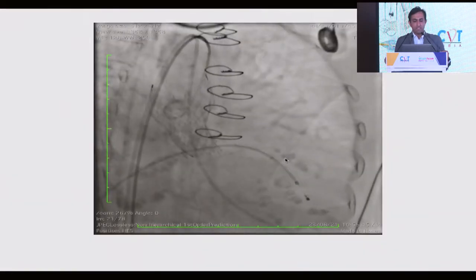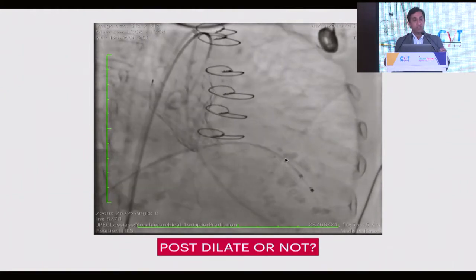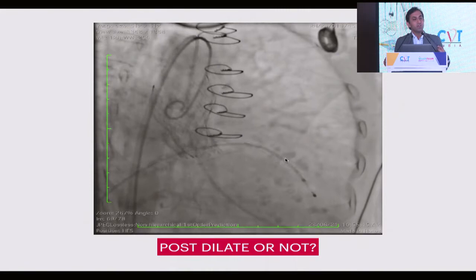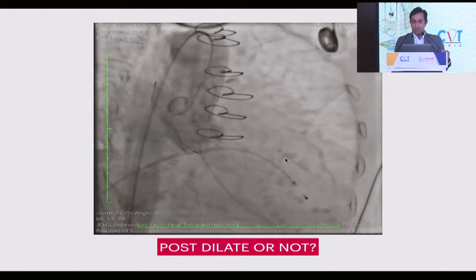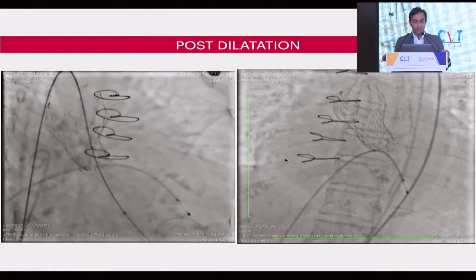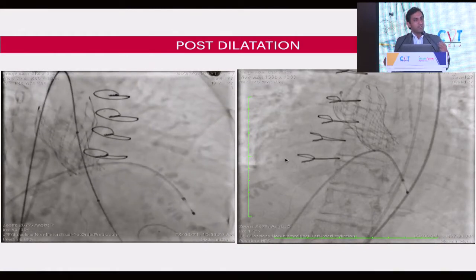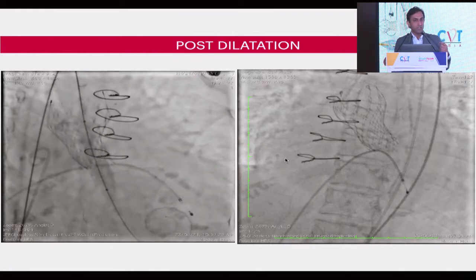And this is the angiogram, there is no leakage, but should we go ahead and do a post-dilatation? Very important. This was a 19 mm Trifecta valve, and what we know is we cannot fracture it, but we can definitely modify it. The balloon chosen is a 20 millimeter balloon. The balloon has to be 50% in the LVOT and 50% in the valve, because the LVOT portion of the balloon will anchor the valve. You cannot be very high.